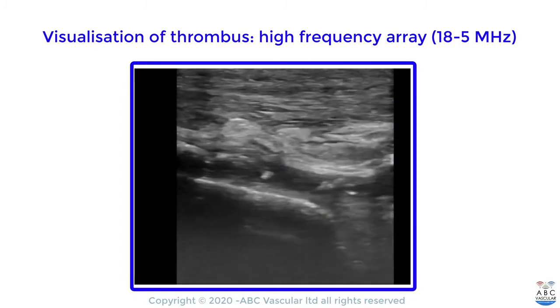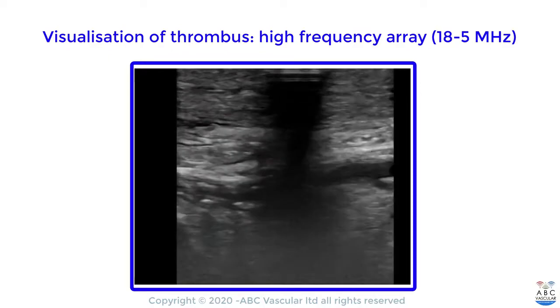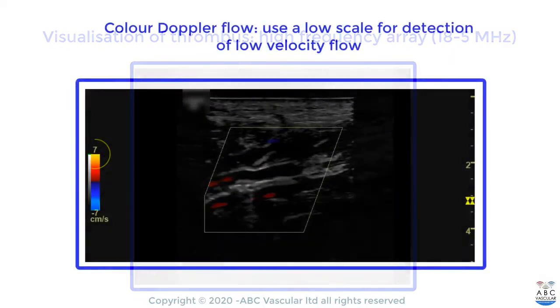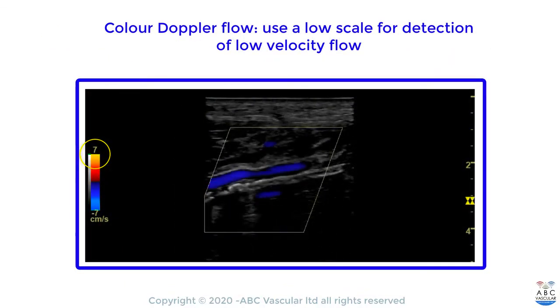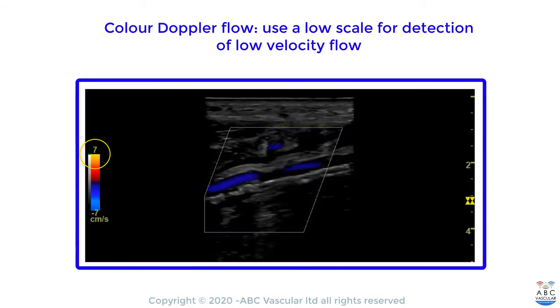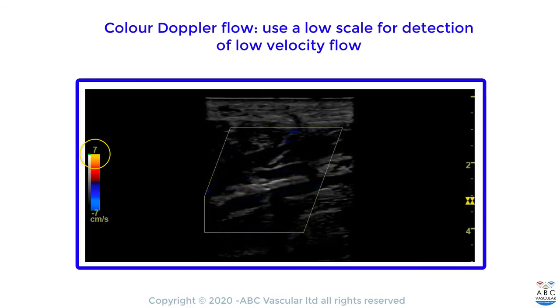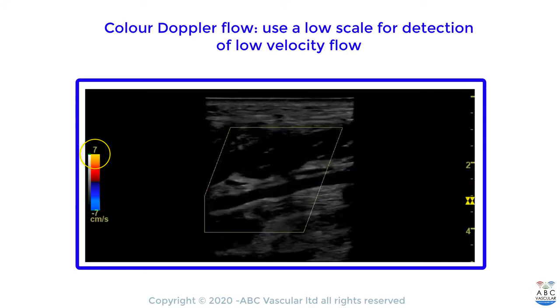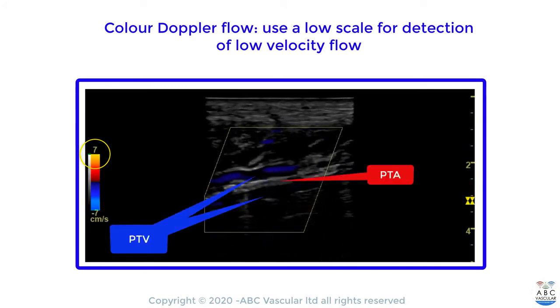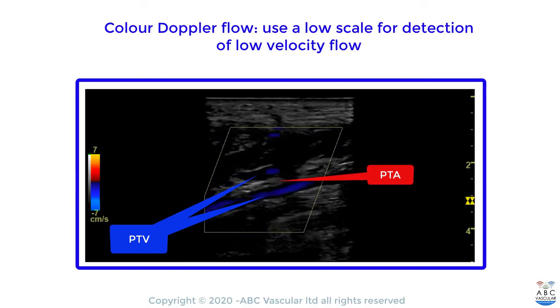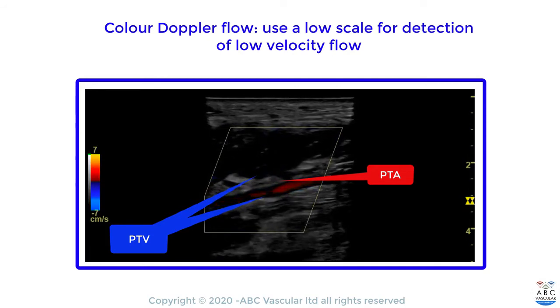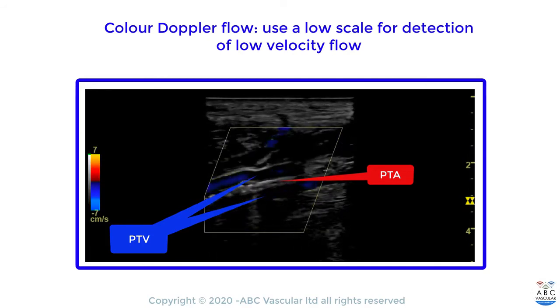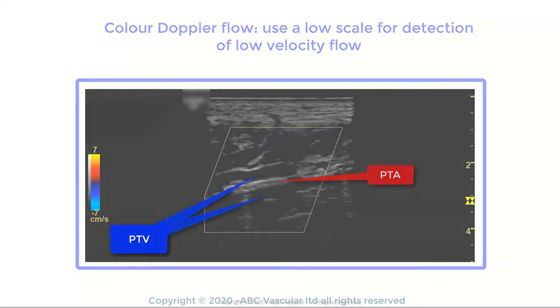In order to confirm the presence of an occlusion, we can use color Doppler flow. We must use a very low color flow scale, as represented in this video, in order to detect any low velocities. As shown in this video, while there is color Doppler flow filling the satellite posterior tibial veins, there is no color Doppler flow within the posterior tibial artery, confirming the presence of an arterial occlusion.